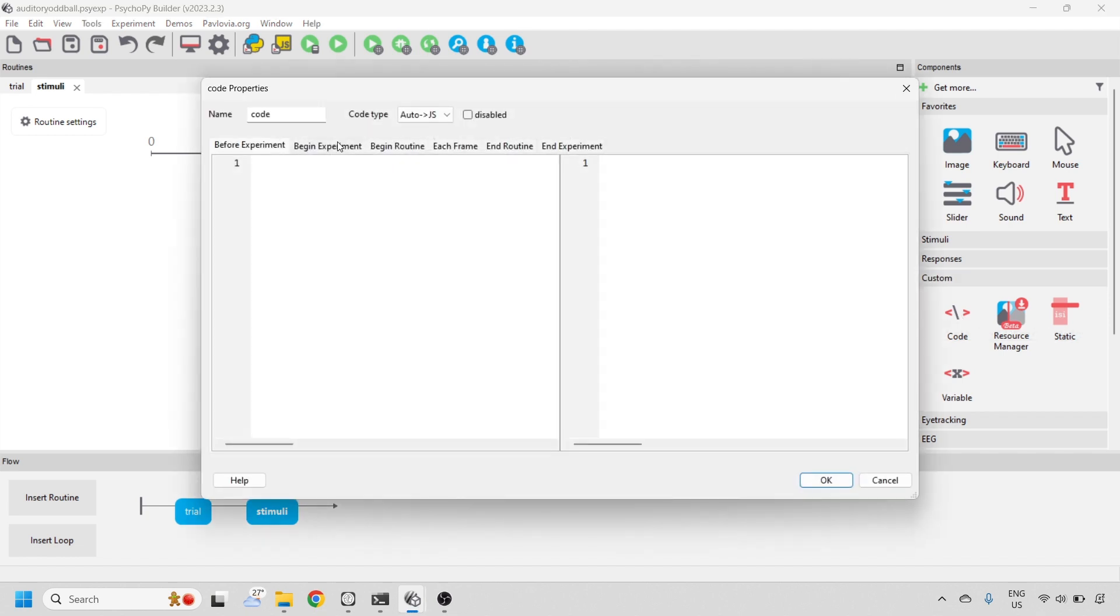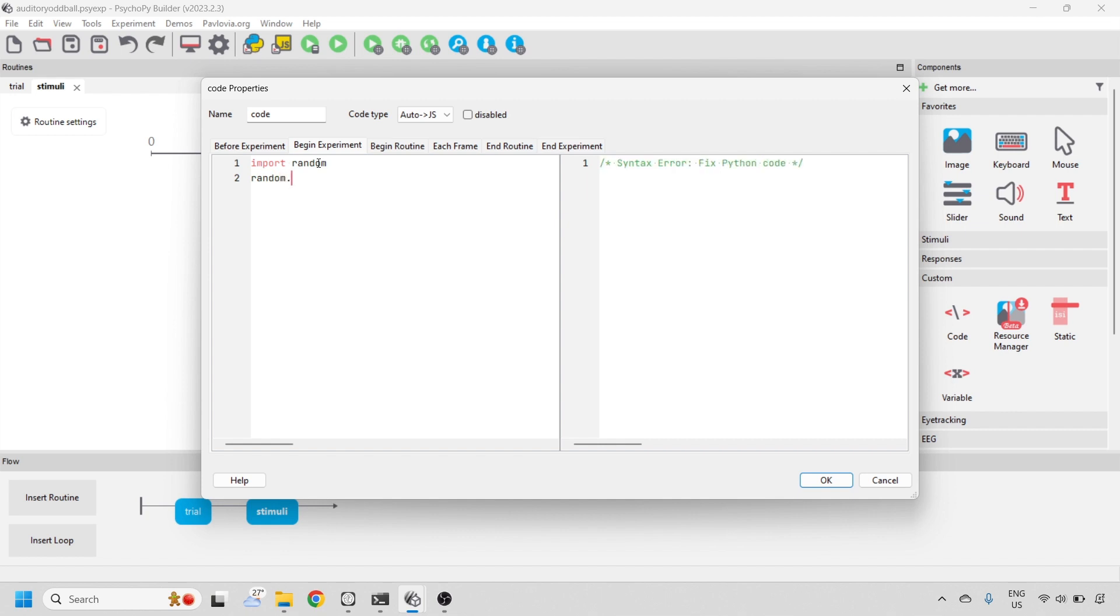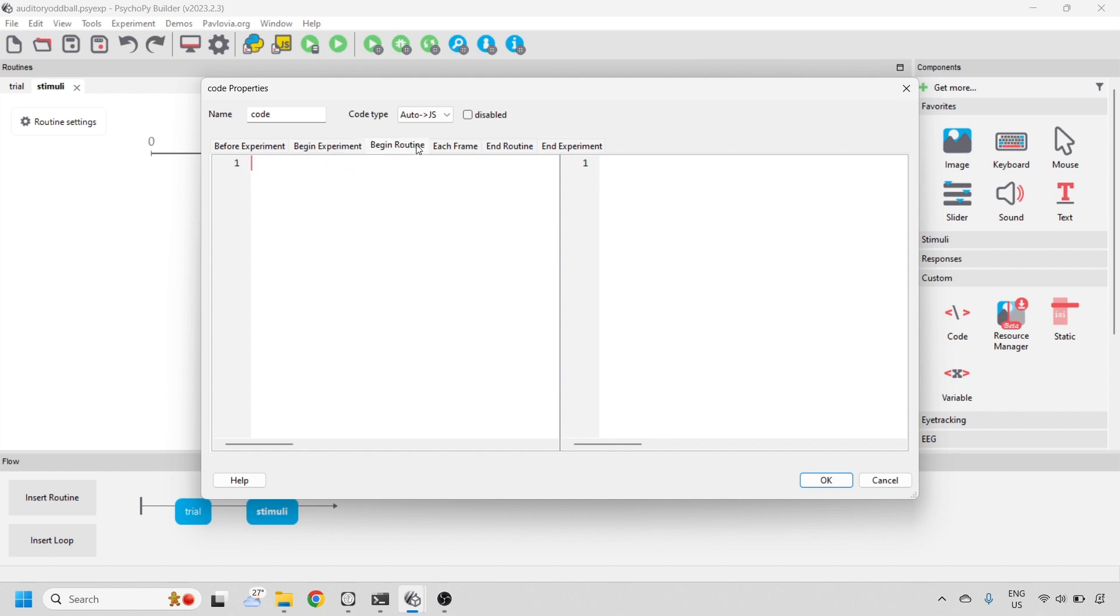At the beginning of the experiment, we can import the packages we're going to use. We can also set a random seed so that our experiment is replicable.